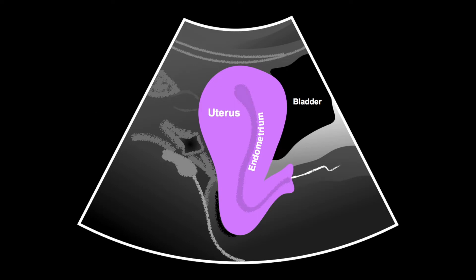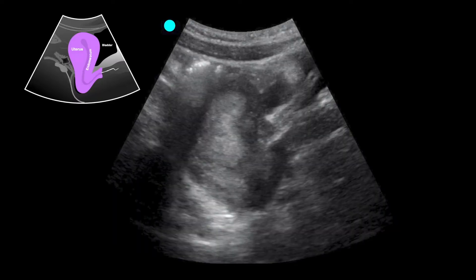For a long axis of the uterus we're going to try to identify the bladder. We place the probe just superior to the pubic bone with the probe marker towards the head, identify the bladder, then you have this white line at the bottom which is your vaginal stripe right through here and then your uterus. Even in this case the anatomy is just slightly different than this ideal drawing, but we can appreciate the anatomy. We first identify this bladder which is decompressed, the vagina just inferior to that, and then the uterus in purple.